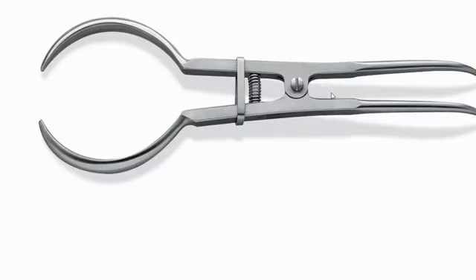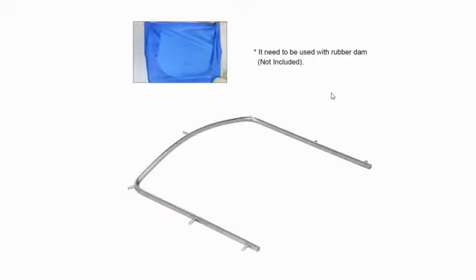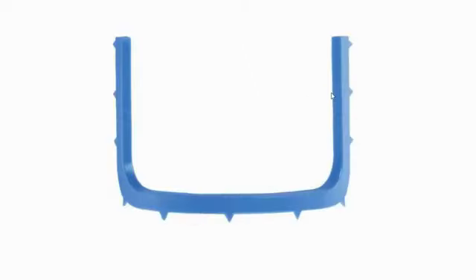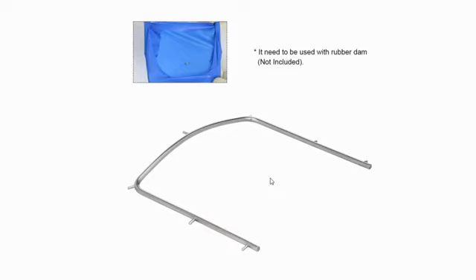The forceps which I told you, which helps the clamps to be placed on the tooth. And the frames, different frames which are available, the single piece plastic and the metal, and I'll say foldable frames which are now fashionable. Now a lot of fashions have occurred of using this type of frames, especially because you can also aram se rotate it when taking a radiograph.